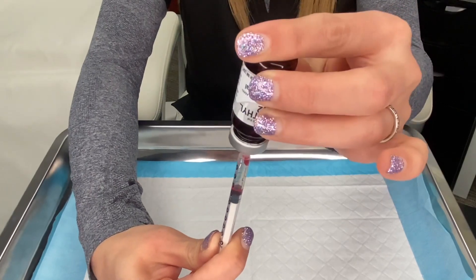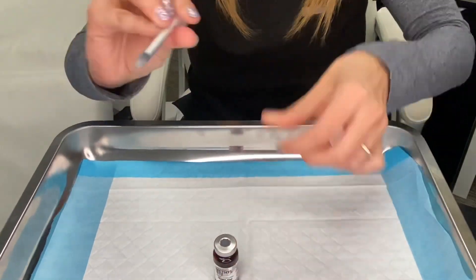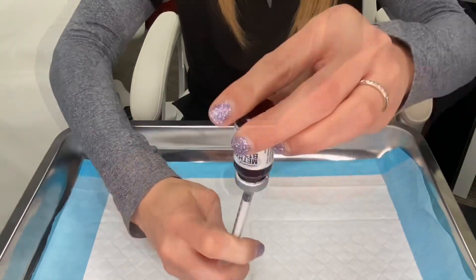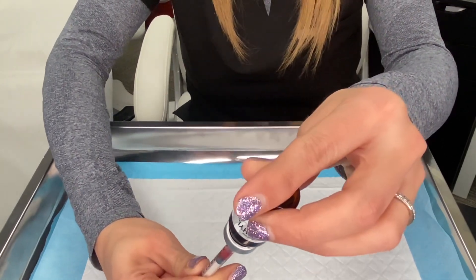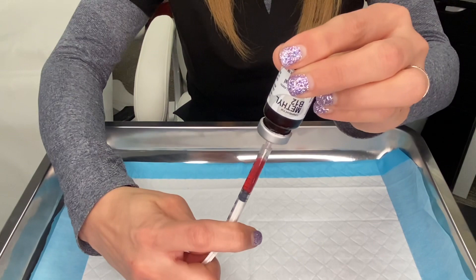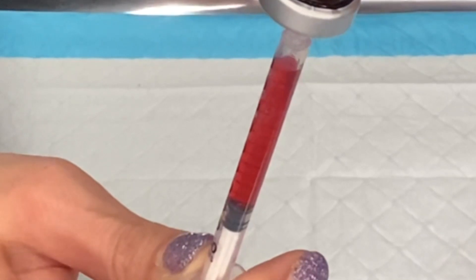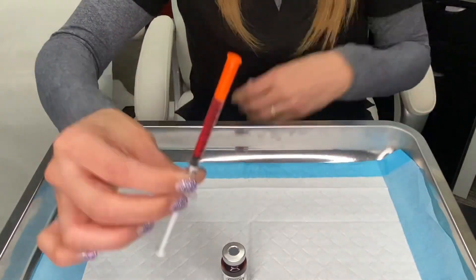Let's see if one syringe of air was enough — it looks like we need more air in the vial because it's coming out very slowly. I'm going to push the B12 back into the vial, withdraw the syringe, pull back on the plunger again, and inject more air into the vial. Now you can see it's flowing much better. Sometimes you may have to add an additional syringe of air to withdraw the medication more easily. Now we have our dose of vitamin B12 for the week ready to go.